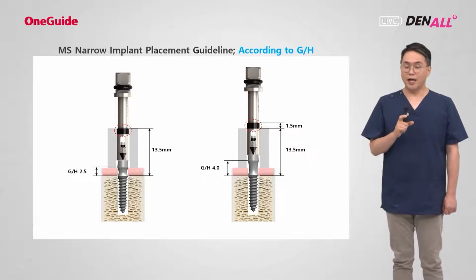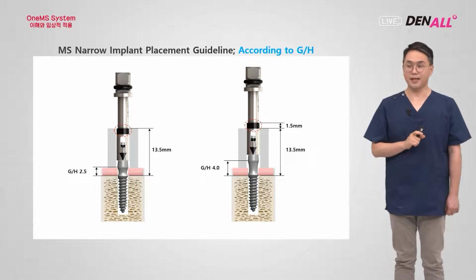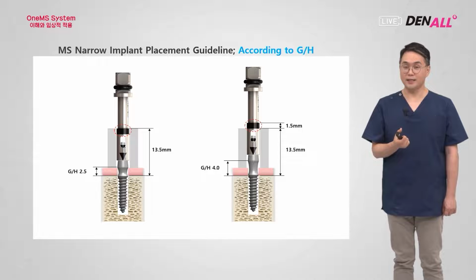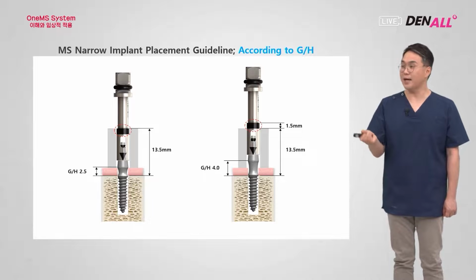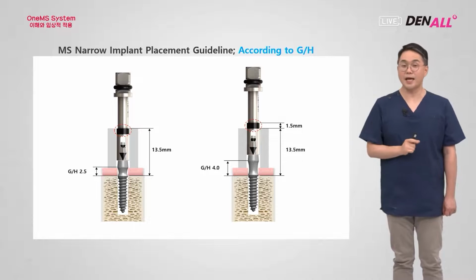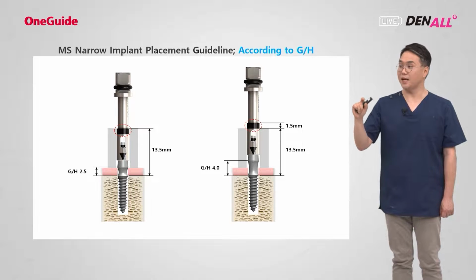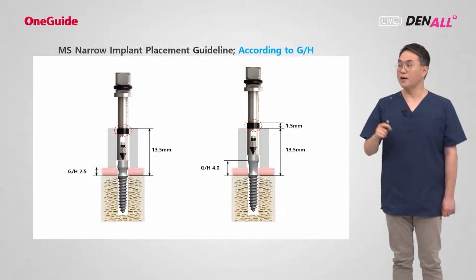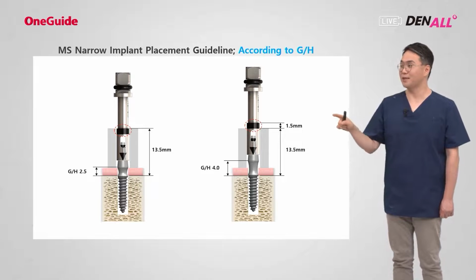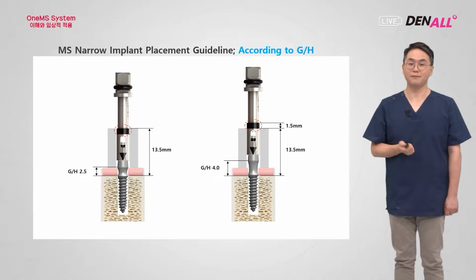Now, the MS implant narrow ridge type is one body type, and for gingiva height there are two variants, 2.5 and 4.0. So the planned implant gingiva height will determine the depth that you need to go into. For MS, you have a dedicated fixture driver, and there is a thick line, and between the top and bottom of the line the gap is 1.5 millimeters. If the gingiva height of your implant is 2.5, the guide hole top needs to go to the top of this line. That's how you control depth. If the gingiva height of your implant is 4.0, then the guide top needs to match the bottom of this line.